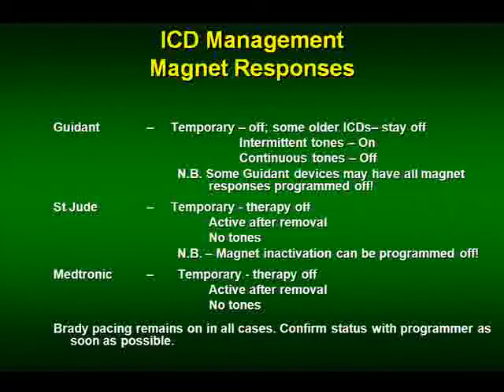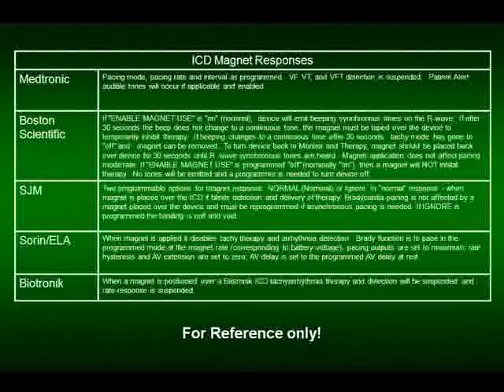These are the 3 major manufacturers in the United States. Guidant now is Boston Scientific. Guidant devices, sometimes you can program the magnet response off. St. Jude devices, you can program it off. Medtronic devices only respond while the magnet's on. Unlike a pacemaker, you don't change pacing with a defibrillator when you put a magnet on, so bradycardia pacing remains on. If you really want to know, this is the company's statements about their response to magnets.